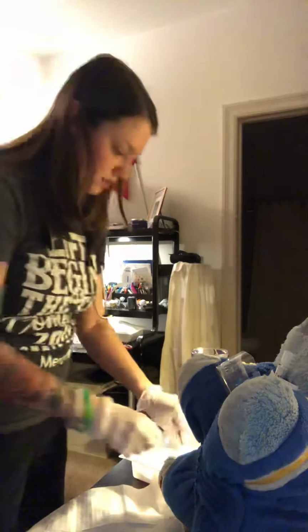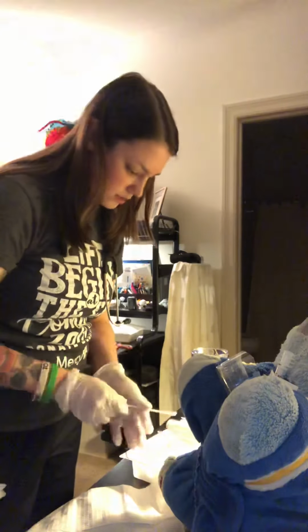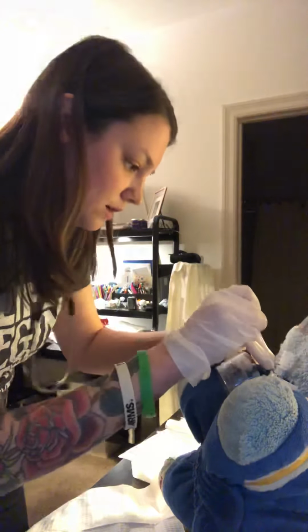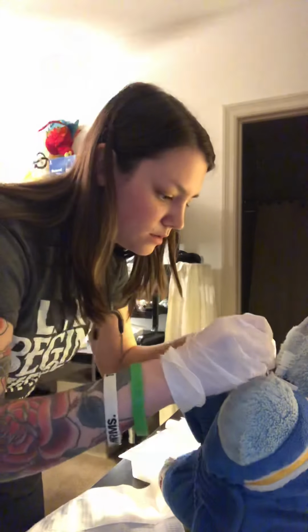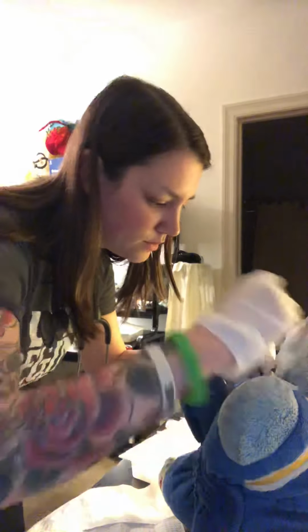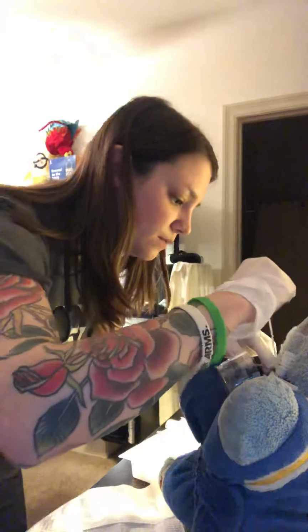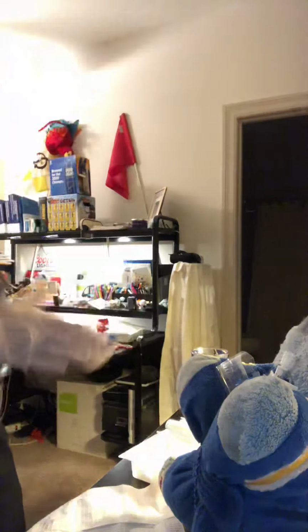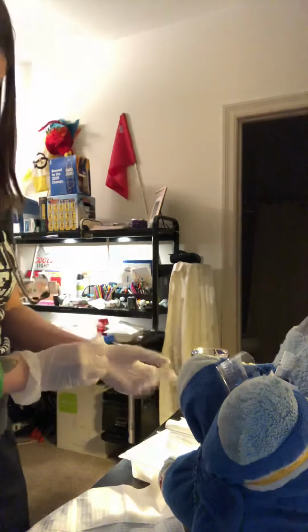Then now I would clean it. So I would use the little applicators that I got here. Clean this all out of here, all around in there. Get it all cleaned up. Then I would dispose of that. So he would be all cleaned up now and new inner cannula in.